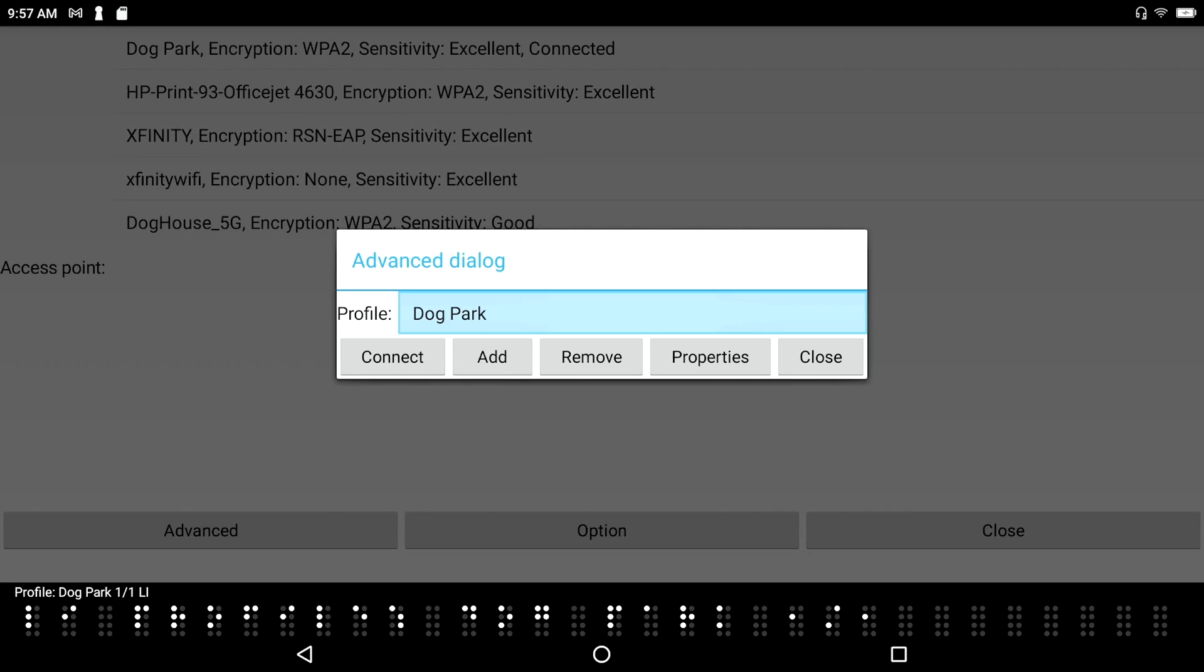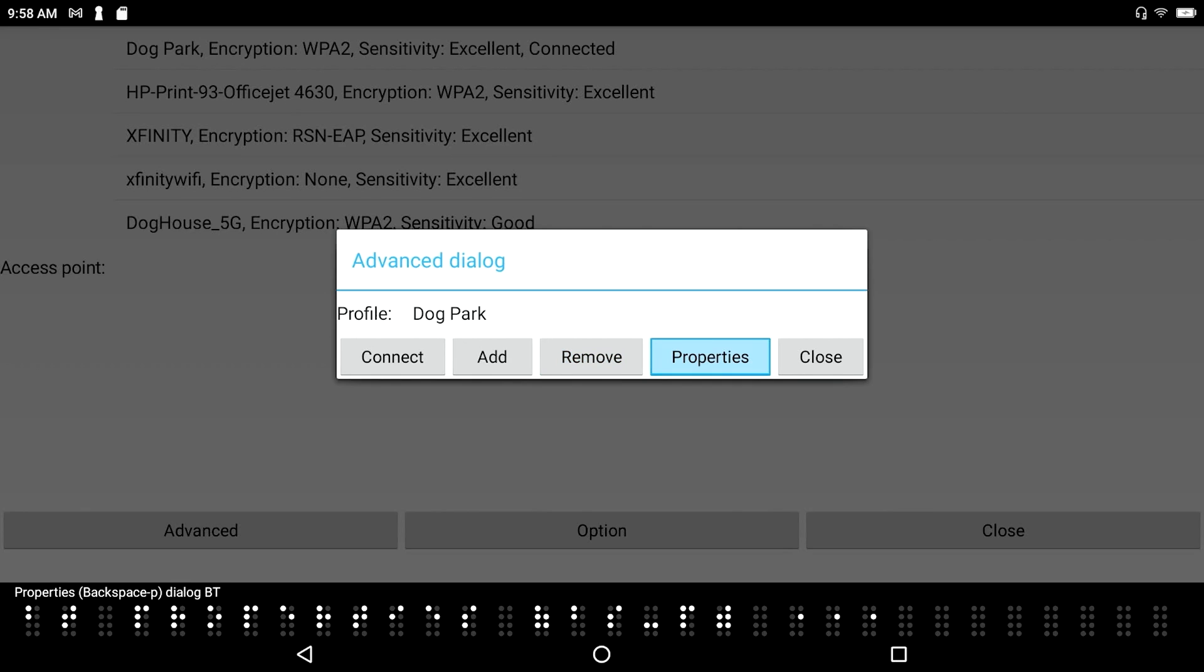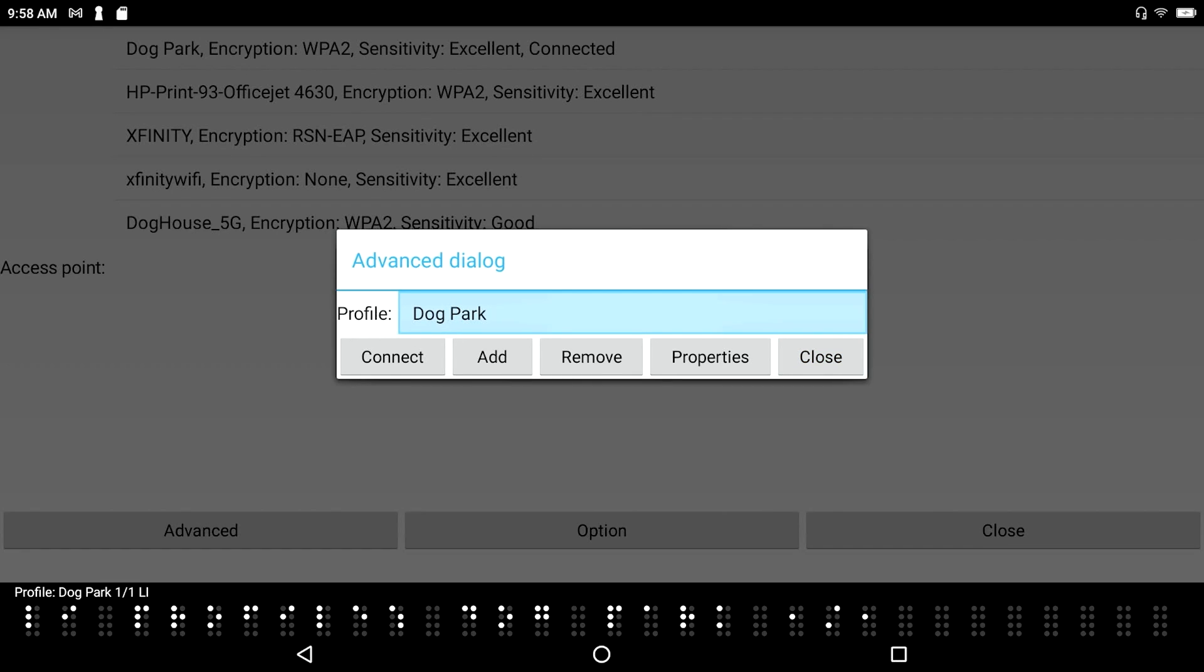Advanced dialog. Profile. Dog park 1-1 list item. Where I see I have my profile called Dog Park. So let's say you get into a situation where you've mistyped the network key. You've got the profile established. But it's not connecting to the network and you want to start again. Well I can either tab through this dialog. Connect. Backspace C. Button. Add. Backspace A. Dialog button. And here connect. Add. Remove. Space D. Button. There's Remove. Properties. Backspace P. There's Properties. Close button. Close. Profile. Dog park 1-1 list item. And I wrap back around to my list of profiles in which in this case I've got one profile. And rather than having to tab over to that Remove button I could just press space with the letter D as in Delete.